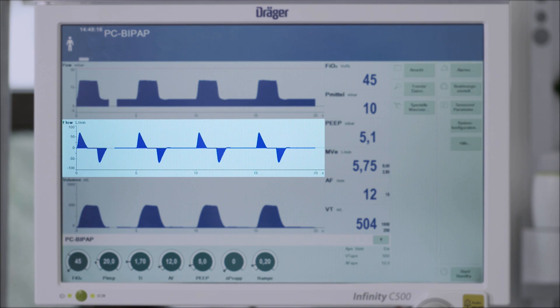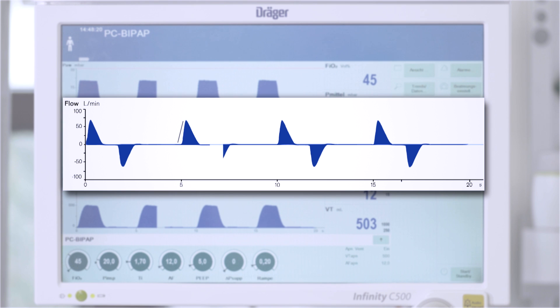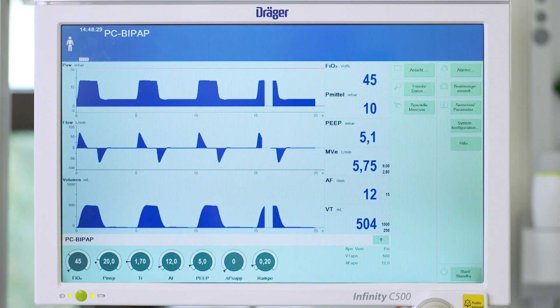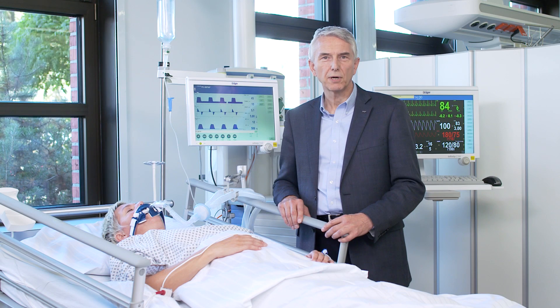PEEP prevents the lungs from collapsing. It increases the end-expiratory lung volume, which increases the surface area in the lungs for gas exchange. The curve in the middle is the flow curve. It shows how the device fills the lungs with gas. While breathing out, the flow is negative — the curve is in the minus.